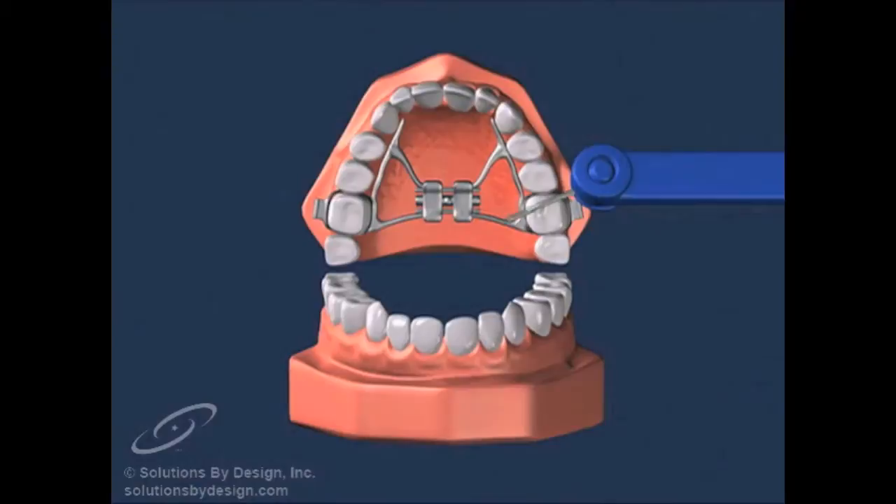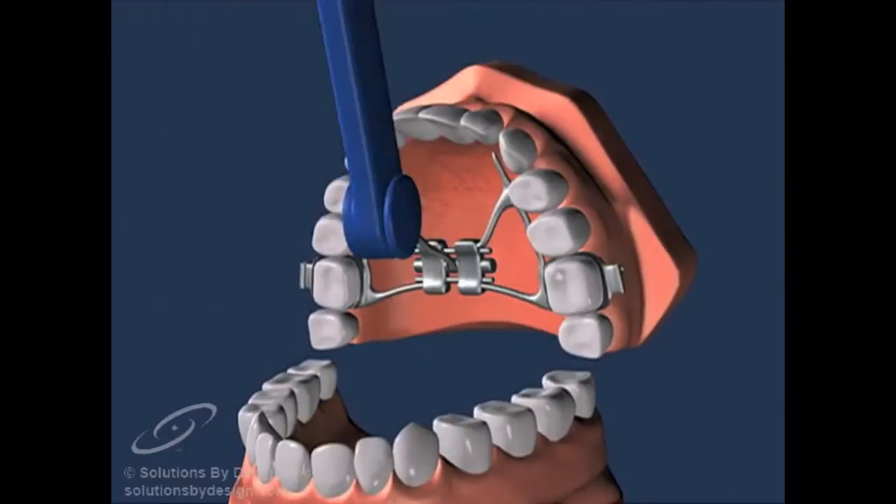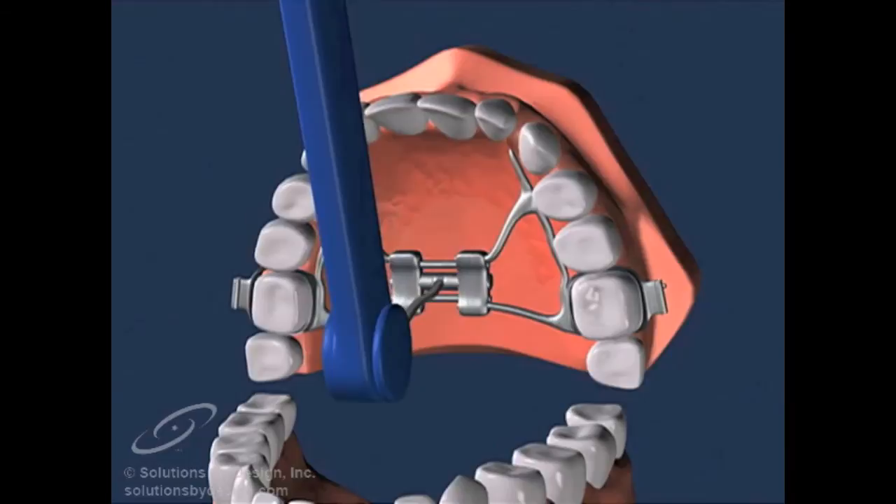A special key is used to activate the expander. Insert the key in its slot — it will not touch the roof of your mouth. Next, push the key all the way from front to back, then remove the key.